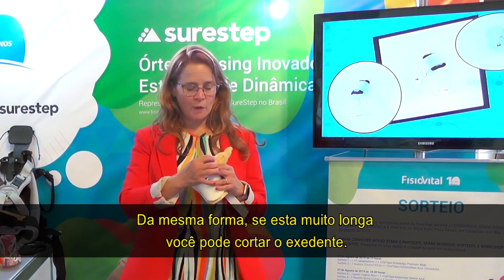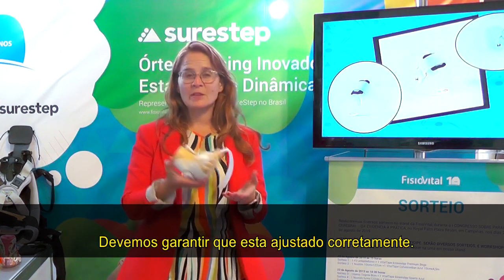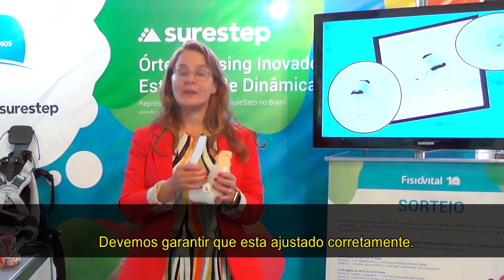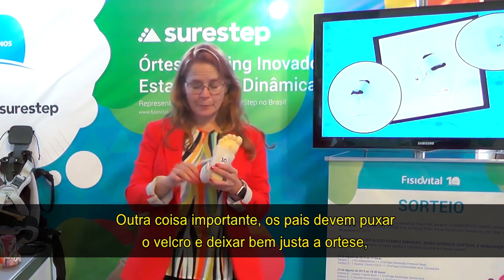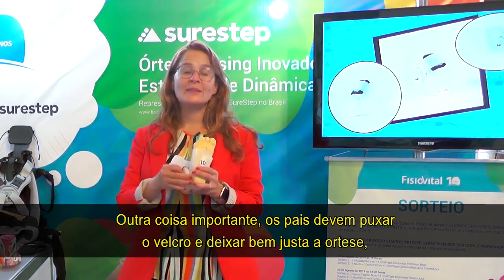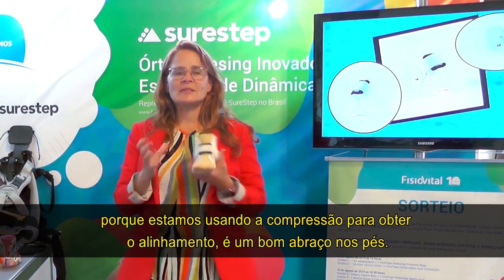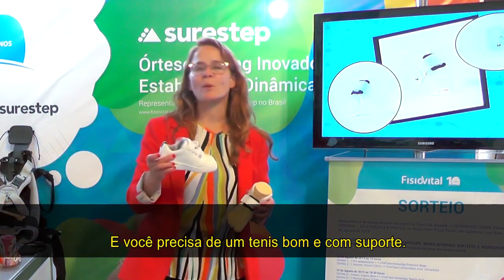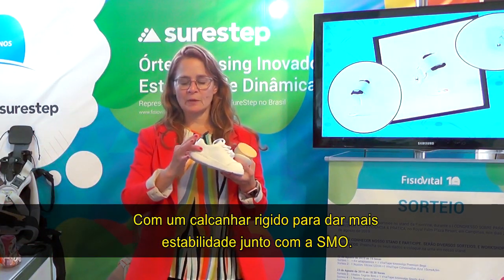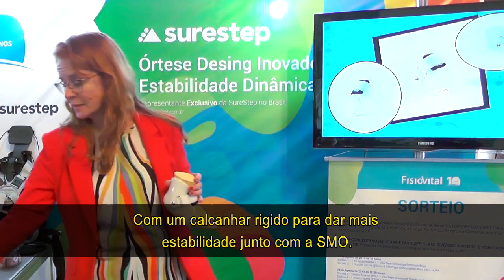If it's too long, draw with a pen and then carefully trim it with scissors to make sure it fits correctly. Parents need to pull it really snug — we're using compression to get that alignment, so it needs to give them a big nice hug. And you need a supportive shoe with a firm heel counter to give them the stability to use this prefabricated SMO.